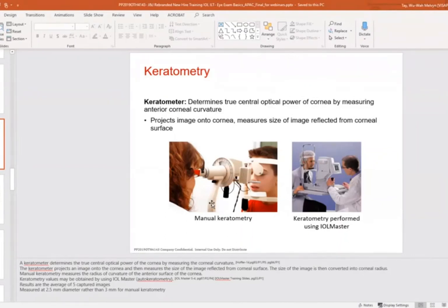Yep. But when it comes to topography, it will give us more for the entire corneal curvature, including the posterior, in case we are talking about Pentacam and Galilei. Yeah, some unique topographers. So we wouldn't call the Pentacam a topographer.